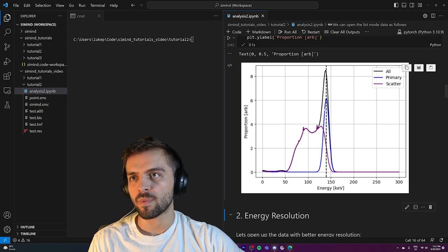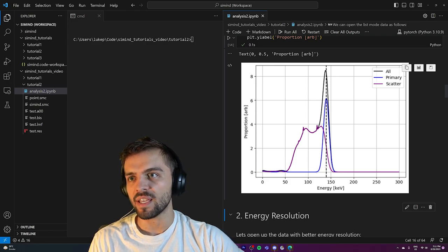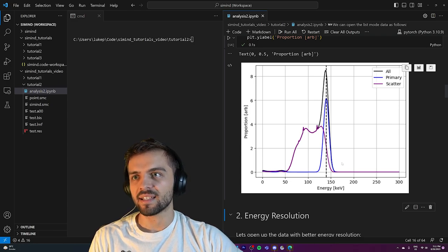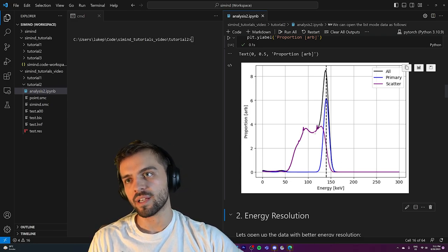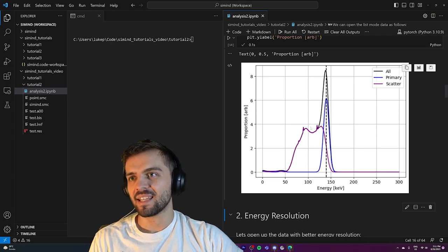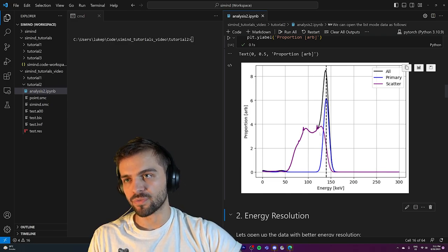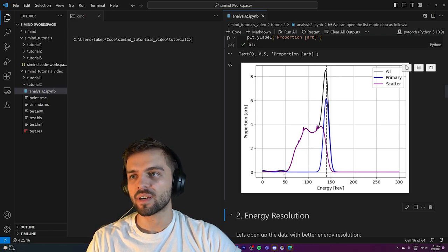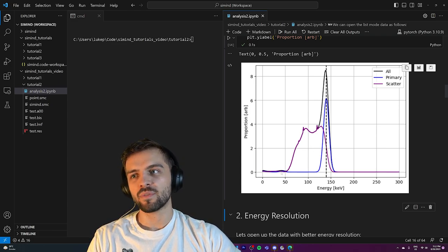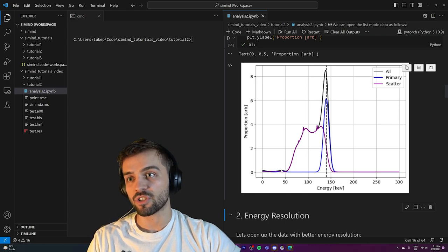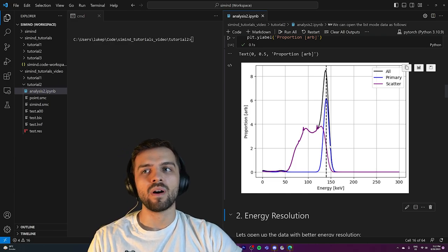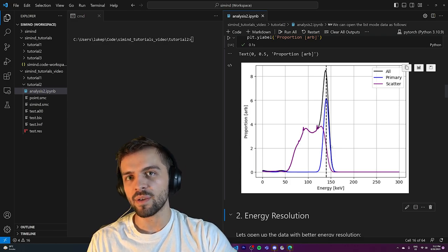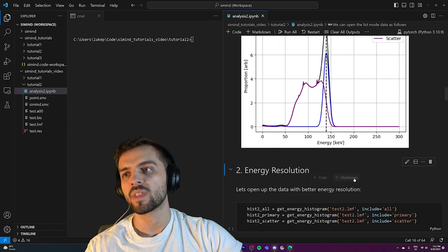We've separated into three different spectra and can see that we're correct about what's happening. There's a primary bump corresponding to photons at 140 keV, but it still has a finite width. The scattered events have less energy as expected, so they're below the photo peak. But what's going on at very low energies? We've simulated photon events of only 140 keV and we're getting energies down here. Also, why is there that finite width — if we're emitting photons of 140 keV, we should be detecting them as 140 keV.